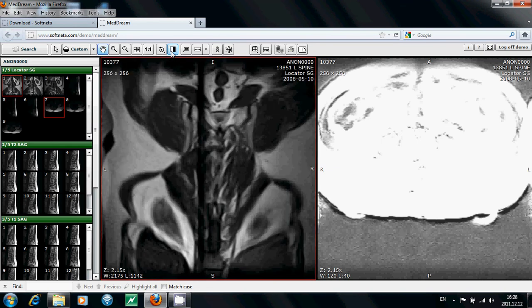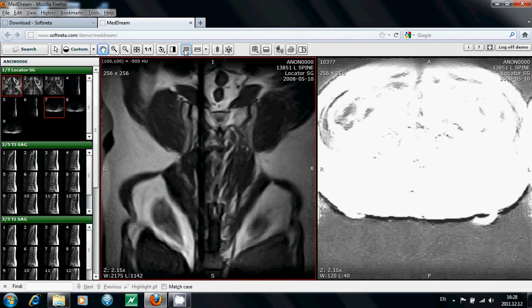MedDream also allows you to measure the images. The intensity button is used to measure the density of the diagnostic image.